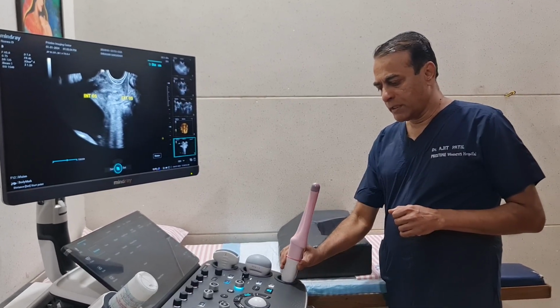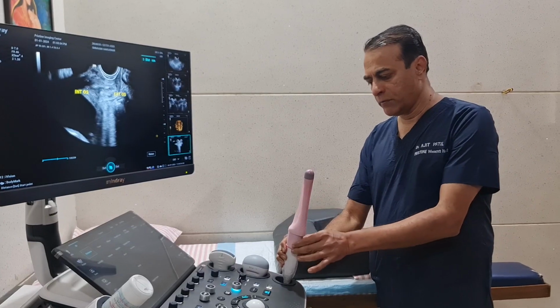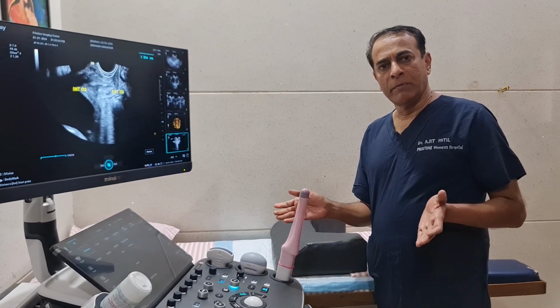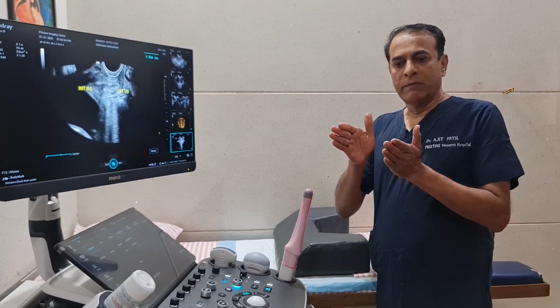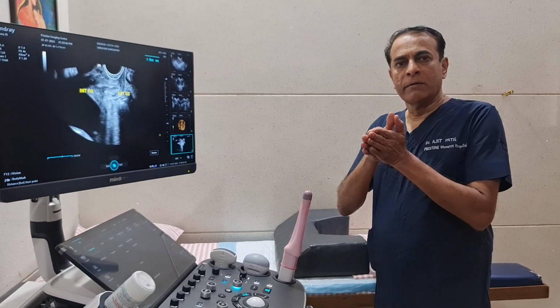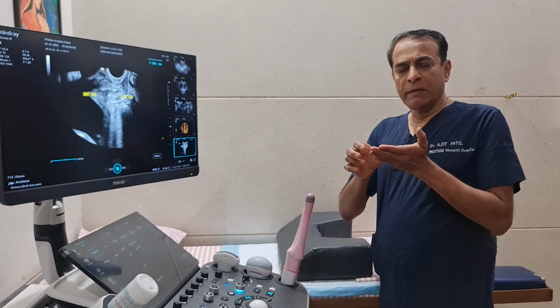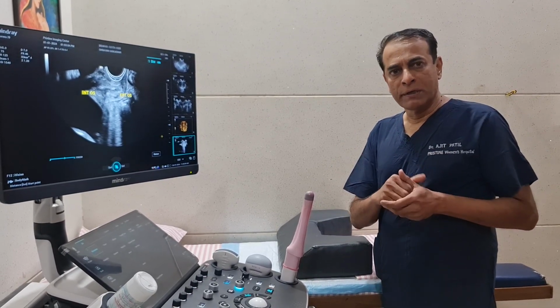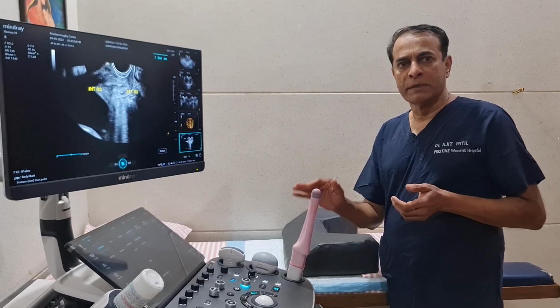We are using a transvaginal probe, and the probe is now covered with a sterile sheath over here. Always examine the patients with empty bladder, because if the bladder is full, it will lead to opposition of the anterior and posterior uterine walls, making the cervix longer. So erroneously, you will end up measuring a longer cervical length. So always examine the patients with an empty bladder.